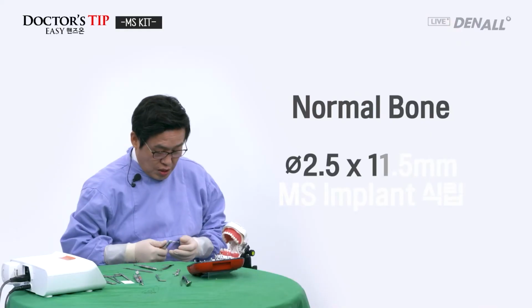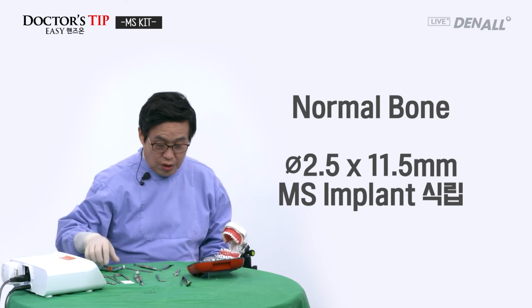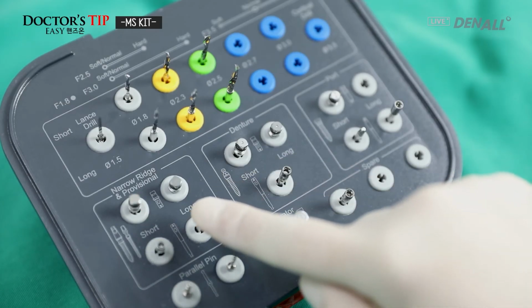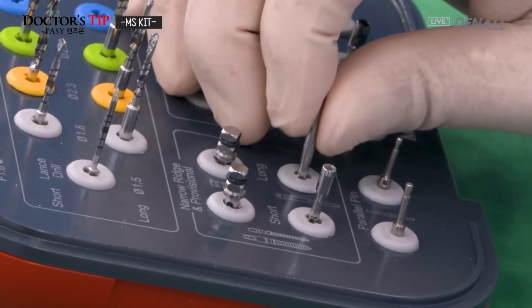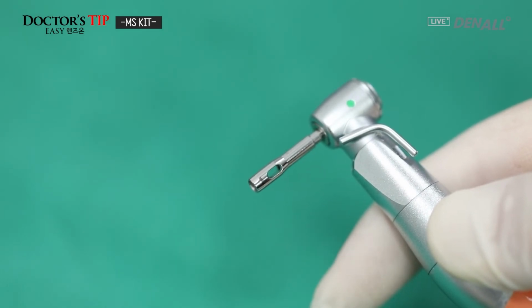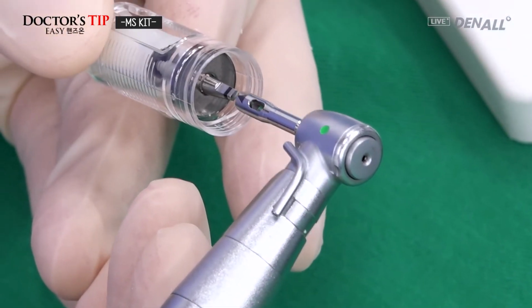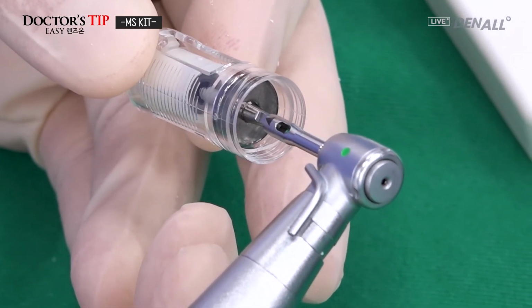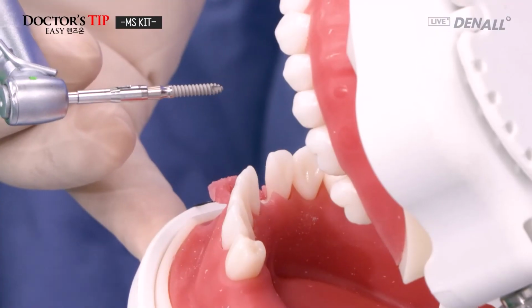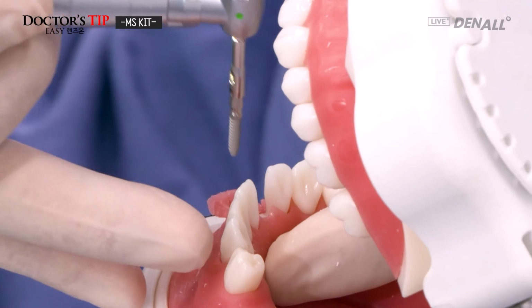And then, in the lower anterior side, let's assume it's normal bone. So a 2.5, 11.5 MS implant will be placed. I will use the no-mount driver, and for the no-mount driver, I use the long type. And change to the placing mode, and it's marked with the triangle, and that needs to connect to the MS fixture's flat part like this. Connect, and you pull it out, and like this. Before pushing it into the mouth, you check that it's in the correct mode, and then place the implant.